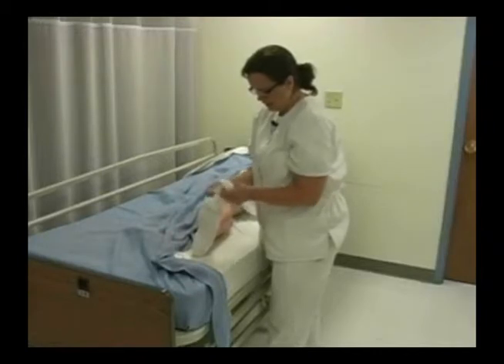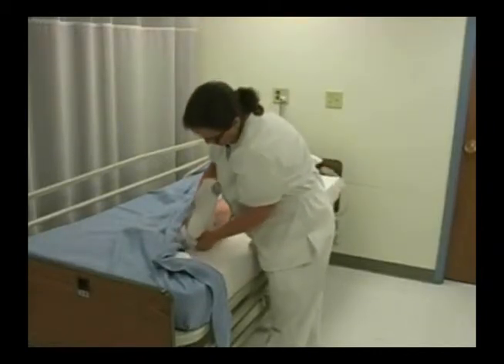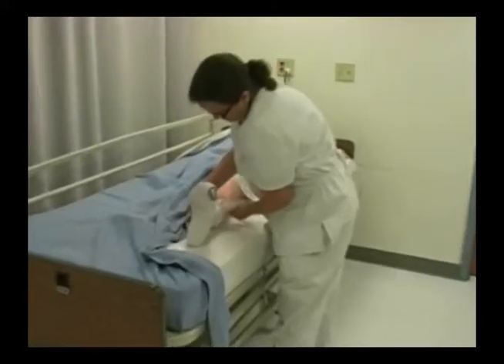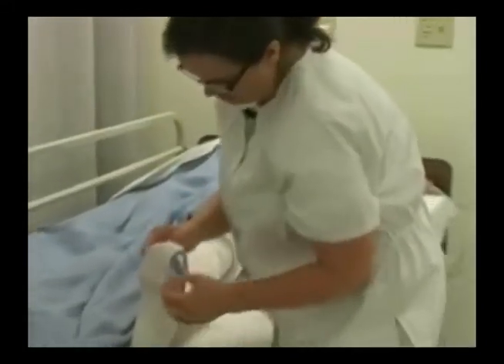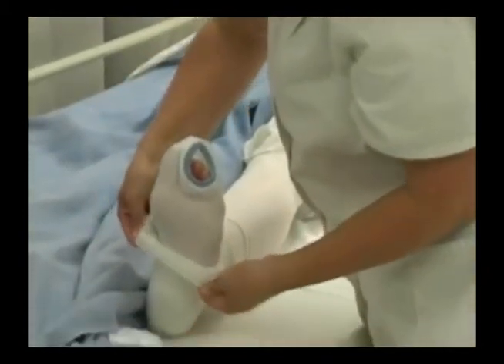Then I'm going to take the rest of the stocking and, in one motion, slide that up their leg. I want to make sure there aren't any wrinkles, so I'm going to be very careful.